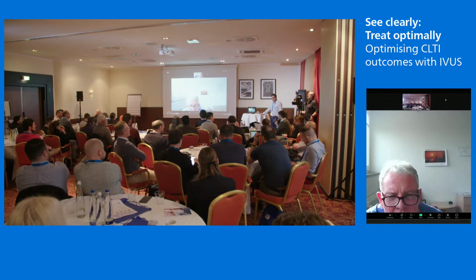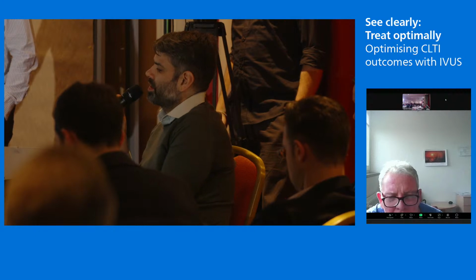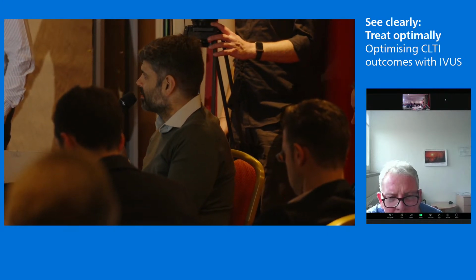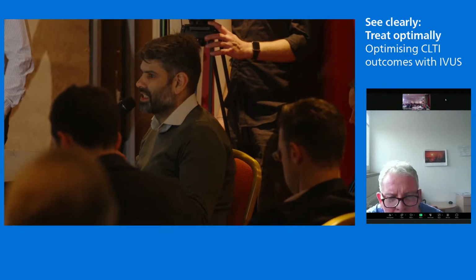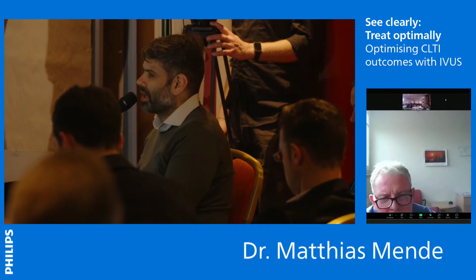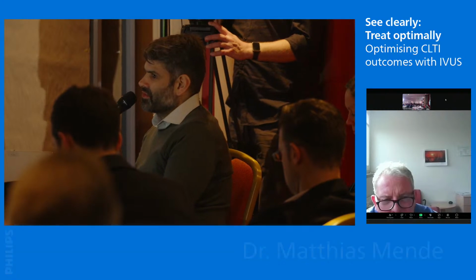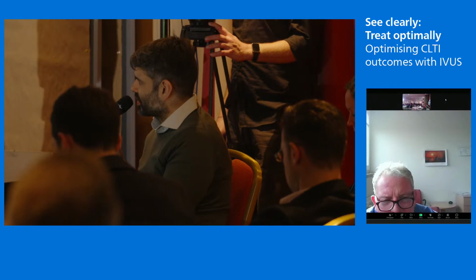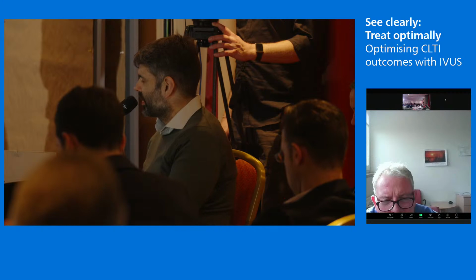So just wanted to explore with you what would be your, because we know that when a patient comes to you with a blocked stent, it's going to be one of either two problems. Either there's a technical problem at one end of the stent that has been missed at the time of implantation, and that's led to sudden blockage or blockage over time, or there's been intimal hyperplasia within the stent. Obviously, IVUS is very helpful quality controlling the transition from stented to unstented to make sure there's no flaps that are going to put the whole thing at risk.